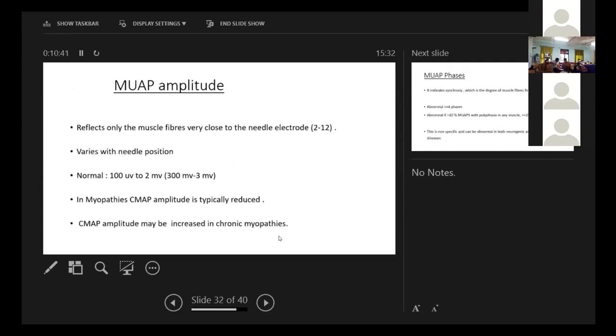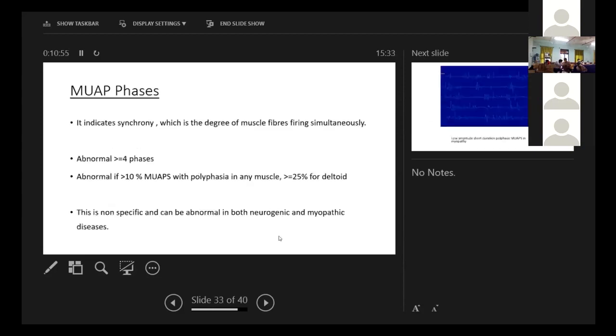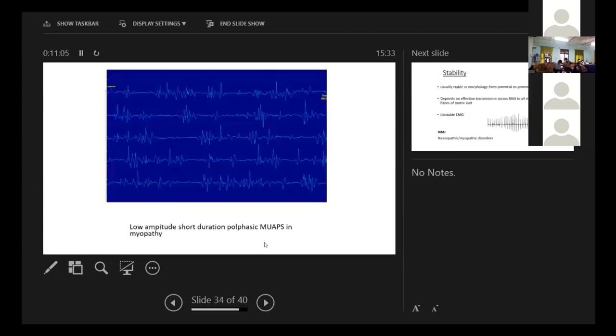Coming to amplitude, which varies with needle position. Normally, it's 100 microvolts to 2 millivolts. In myopathies, the amplitude is typically reduced. Next, coming to the phases, it indicates the synchrony, which means that the degree of muscle fibers which fire simultaneously. If it is abnormal, it is more than four phases. You see, this is a low amplitude, short duration polyphasic MUAPs seen in myopathy.